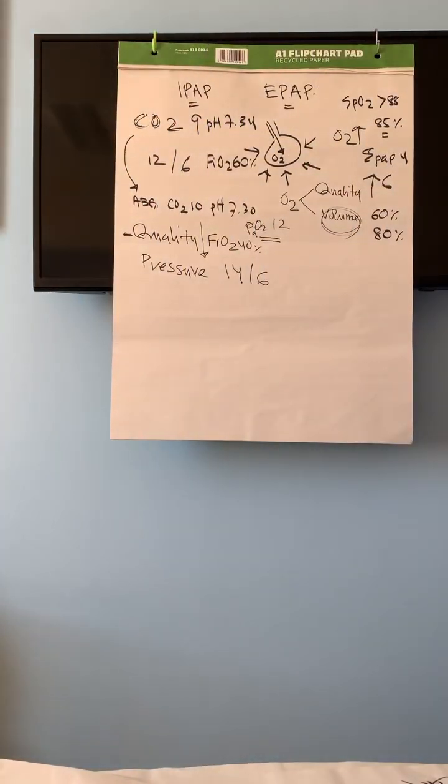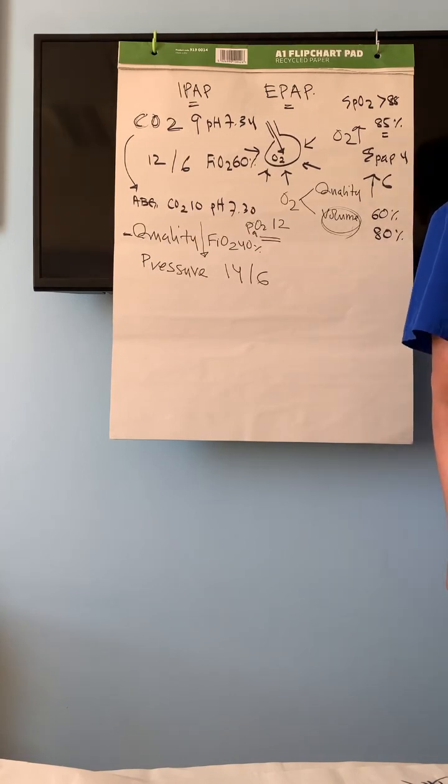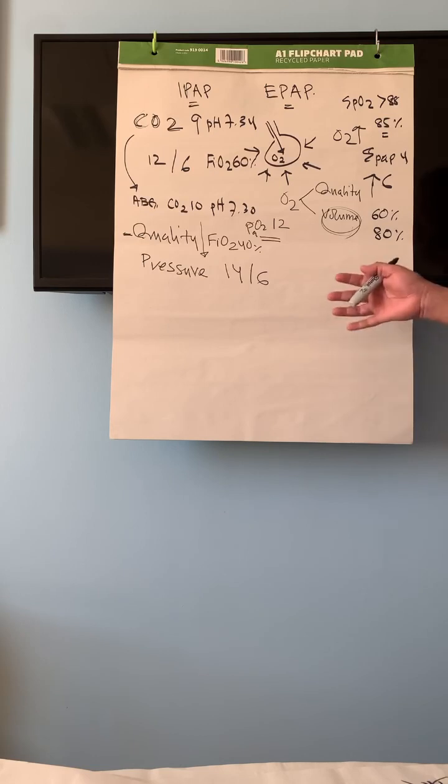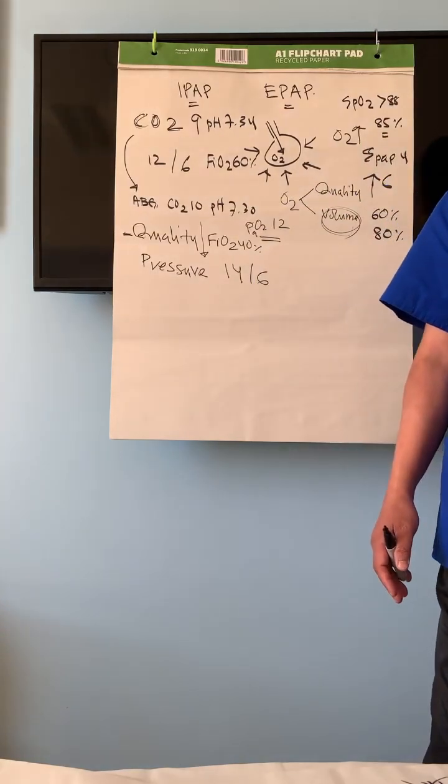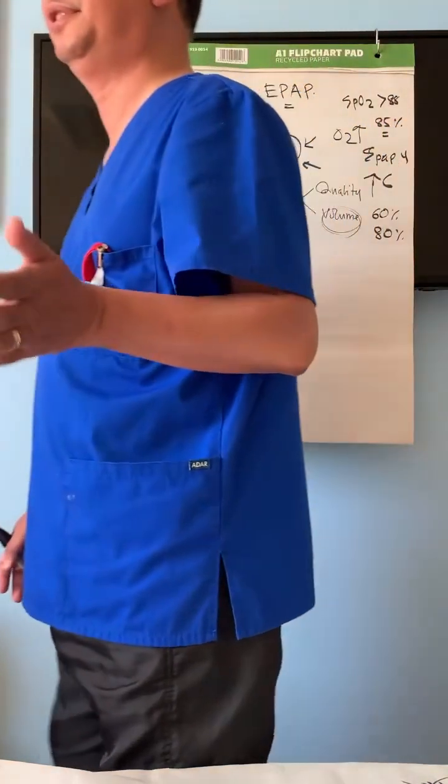Some say that when you start patients on NIV, you normally start the iPAP at a higher range, so that the difference between iPAP and ePAP is around 10. What do you think? Well, yes, sometimes we can go up, sometimes the difference is 12. But as a rule, it's better to start low and go slow and adjust as required, because don't forget, pressure is always the injury.